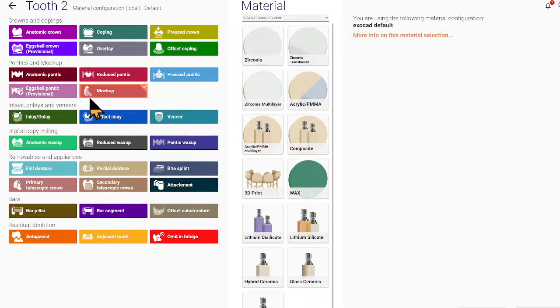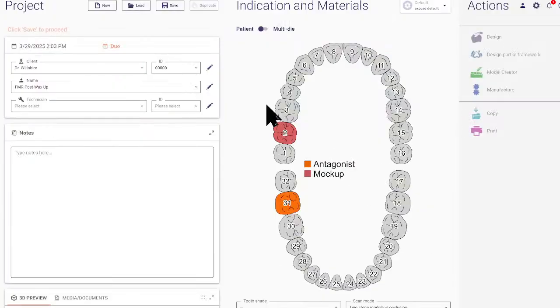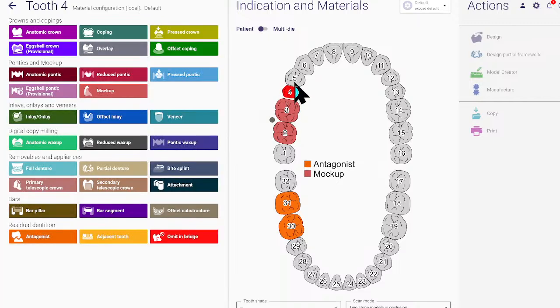Okay, so for this, since we're gonna do a mock-up, press OK. We're doing a 3D print, and then we're not doing virtual extraction, so you could leave that. You don't have to check this. Press OK. Okay, so I'm pressing Shift. Hold on, let's uncheck this.